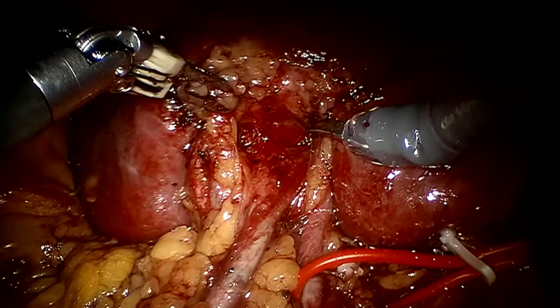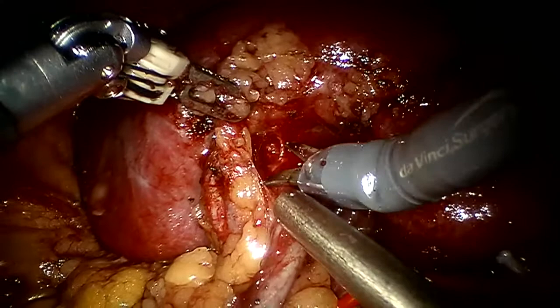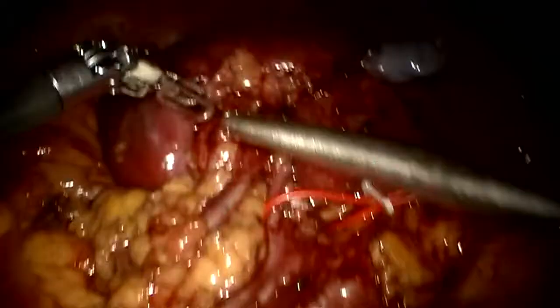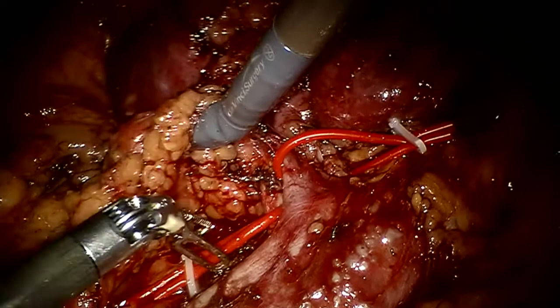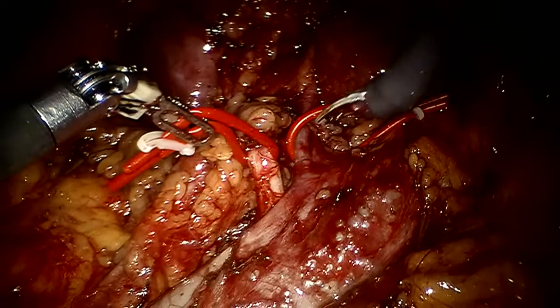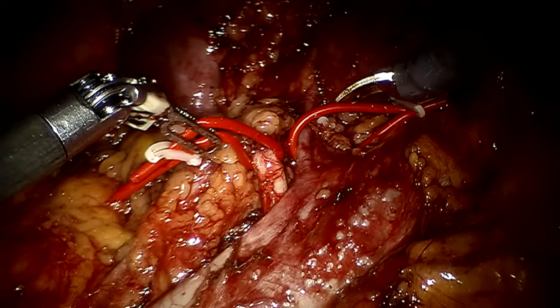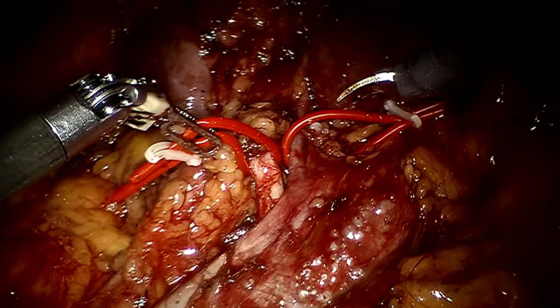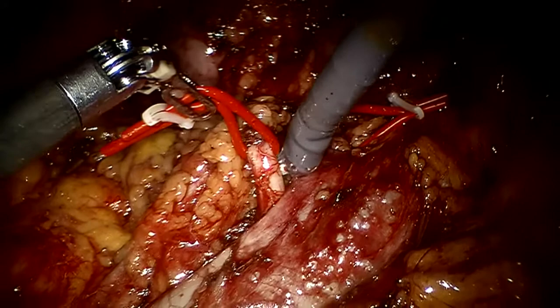Suction, please. Nice and gentle. Good. Okay, I think we should just now go for it. This one clearly we need to go, so we'll figure it out on the fly. Okay, bulldog, please. We're going to put a bulldog on the artery and the vein, because I don't want back bleeding or all that good stuff. Okay. The strategy to clamp the vein is because you are on the right side, or it's a very central hilar tumor, as you saw, and there is absolutely going to be back bleeding because we are going to be cutting into the main renal vein here.